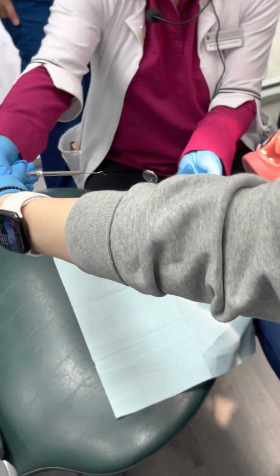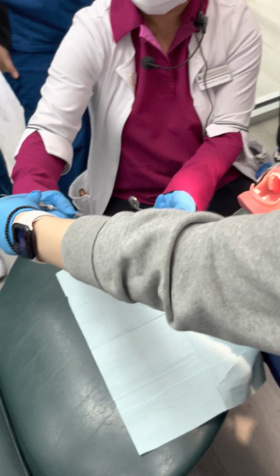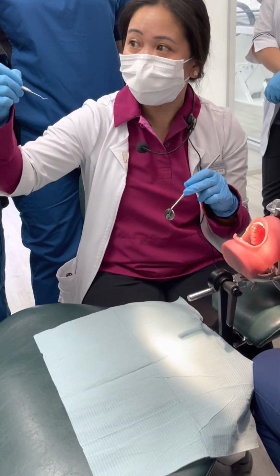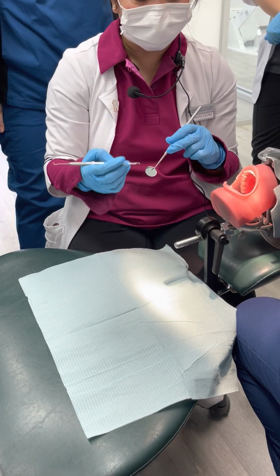So you hold the end, right? Because when you pass it to the dentist, the dentist will just hold it like that. Okay, so give it to me. I am a right-handed dentist. The mirror is my retracting instrument, and this is my working hand. So you pass the instrument that I use to work on the mouth, right?